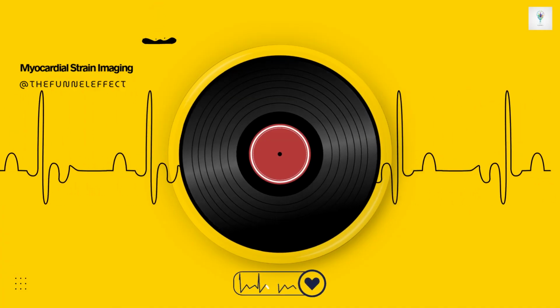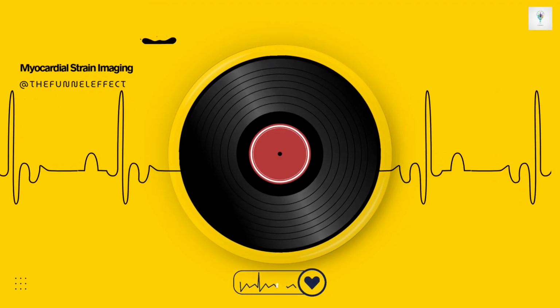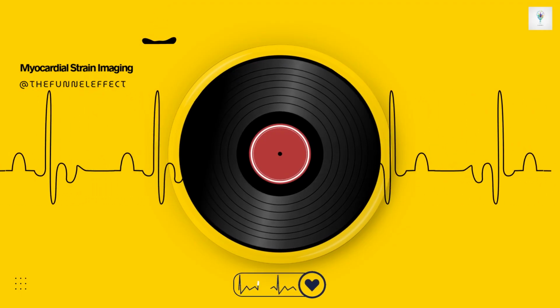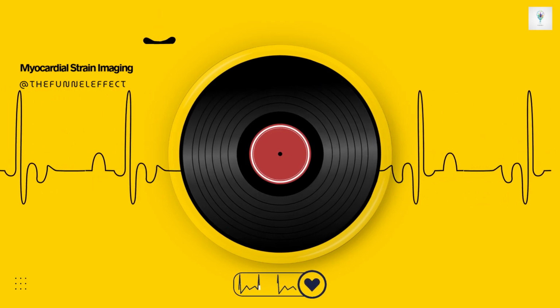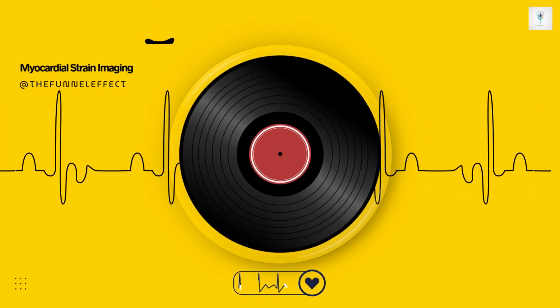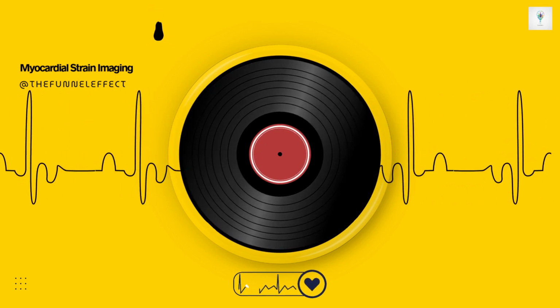And that's where 2D speckle tracking echocardiography, or STE, came in and kind of saved the day for clinical echo strain. Exactly. STE solves the angle problem. It works by tracking the natural acoustic markers within the heart muscle tissue itself, these bright and dark interference patterns that we call speckles.